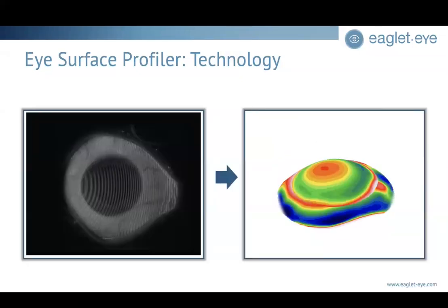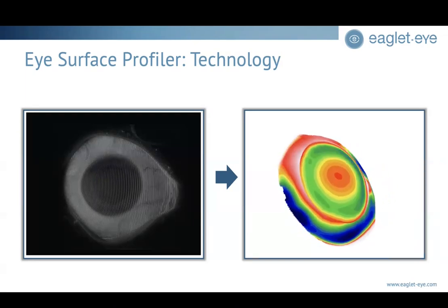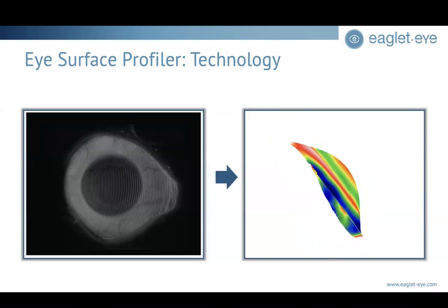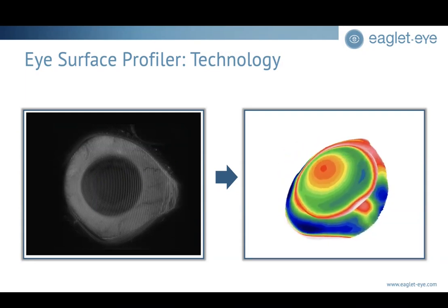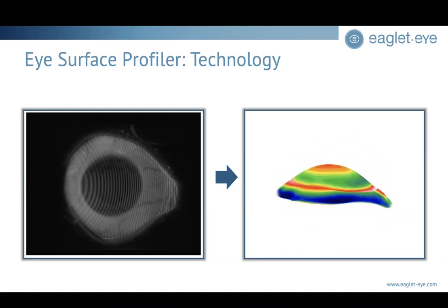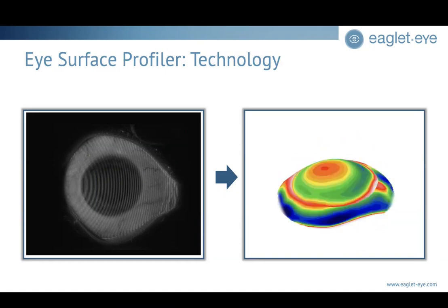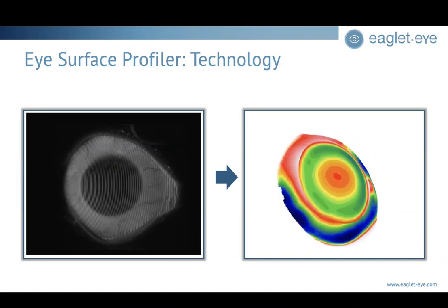Now, our eye surface profiler, just to highlight again that there's really no hole in the data. When we take measurements, there's an equal density across the whole anterior surface of the eye. So everywhere that there's fluorescein that's exposed with the lids moved out of the way is where we'll get data. On your left-hand side is a raw eye image. There's fluorescein on this eye, and the lines across it show where the light is reflecting. And the output is on the right-hand side, giving an elevation map, again, based on best fit sphere of the sclera and then a second one of the cornea to give us exact, accurate elevation heights of an eye.